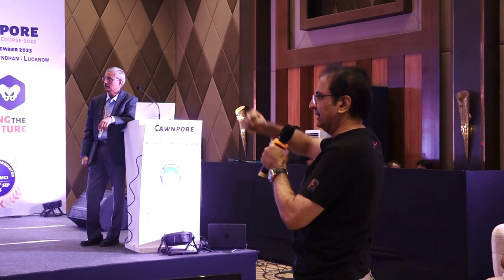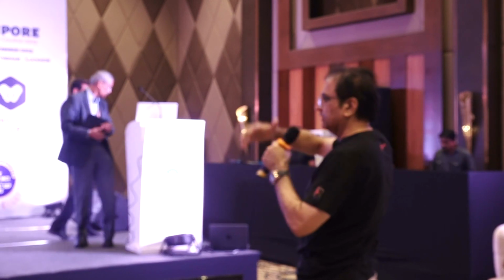So one question to the panelists. In a pelvic discontinuity, do you have experience of using a distraction technique where you are not putting any cage but using a bigger cup, distracting the top and bottom fragments and letting it fall on the cup?